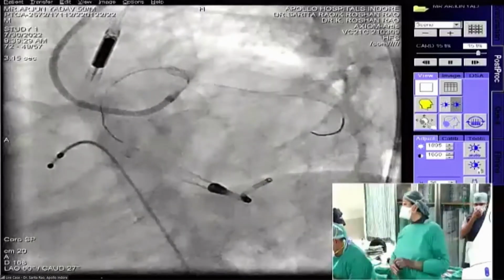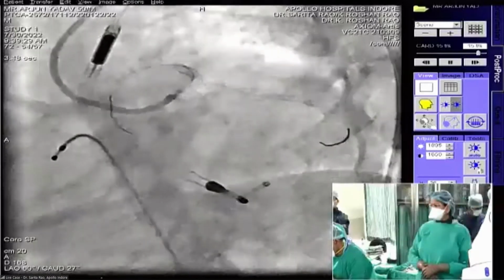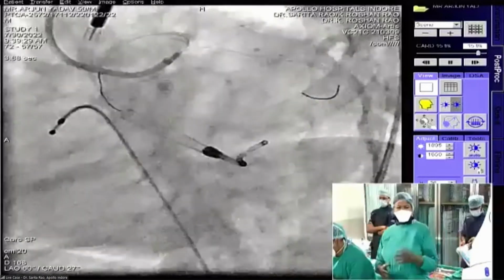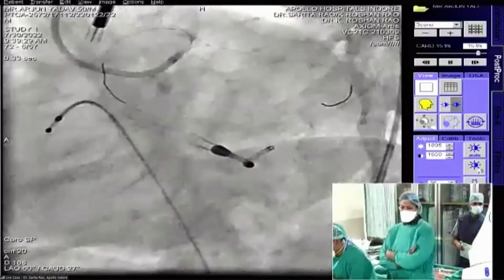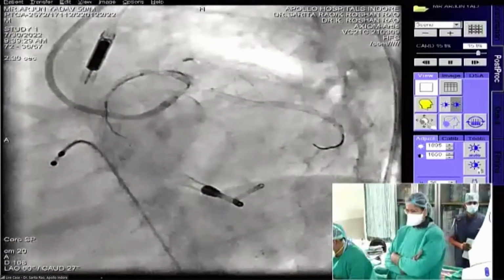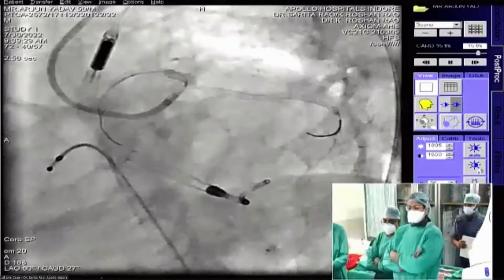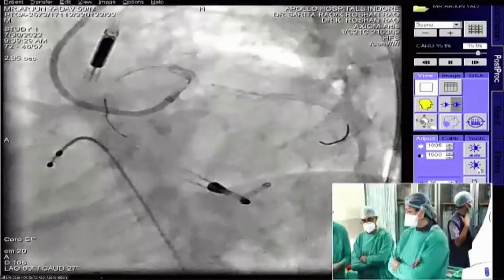Raj, can you tell me what was the OCT area? With the 4x6, we had gone up to 20 atmospheres pressure. And after listening to your discussion, I think I agree with Dr. Dagubati and the rest that I don't want to touch that circumflex. Okay. Regarding your point about the left main, maybe I can go up with a 4.5. But let me just look at the area.